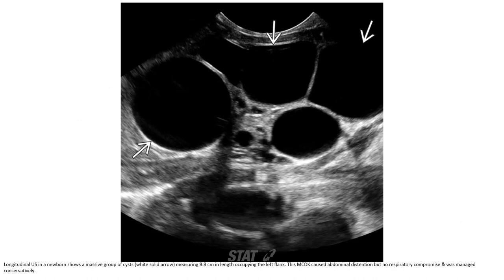Ultrasound in the newborn shows a massive group of cysts measuring 8.8 cm in length occupying the left flank. This multi-cystic dysplastic kidney caused abdominal distension but no respiratory compromise; the patient was managed conservatively.